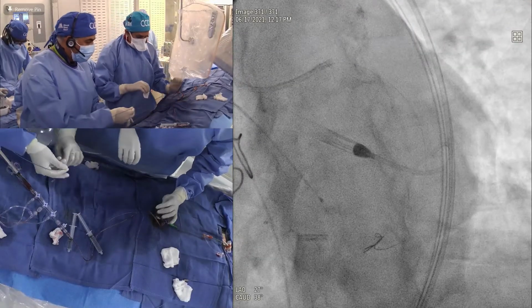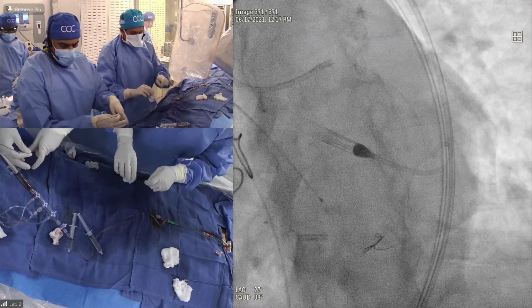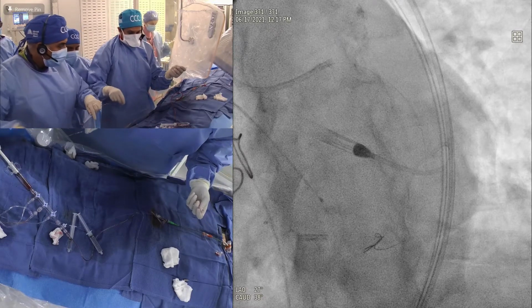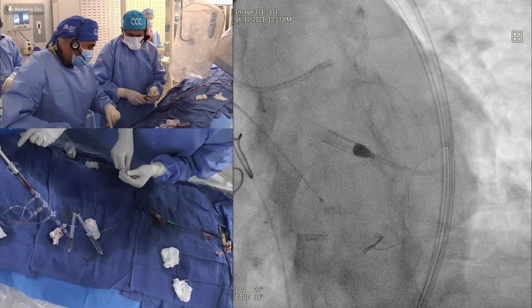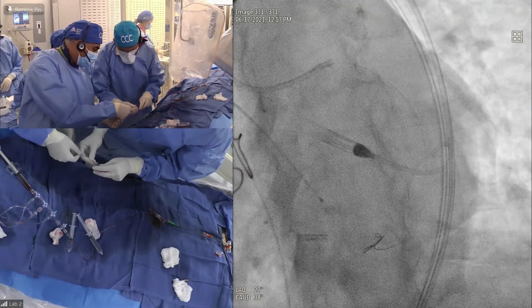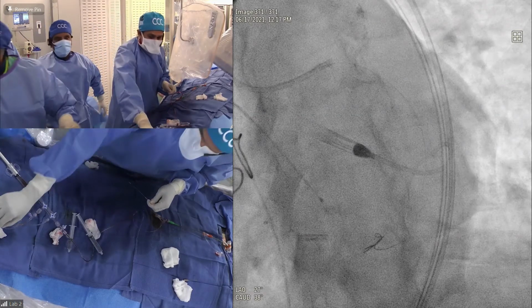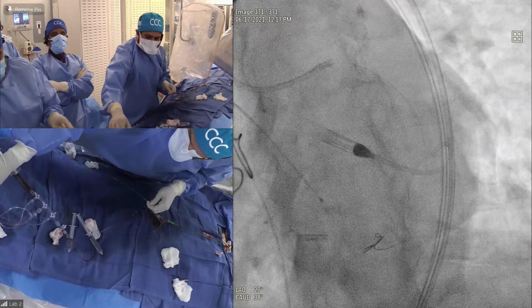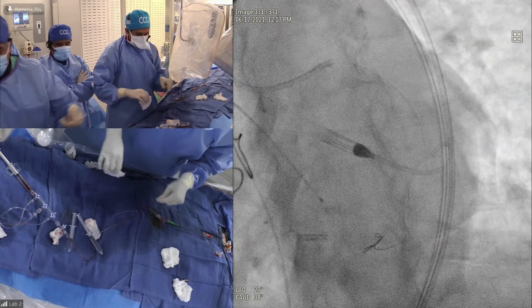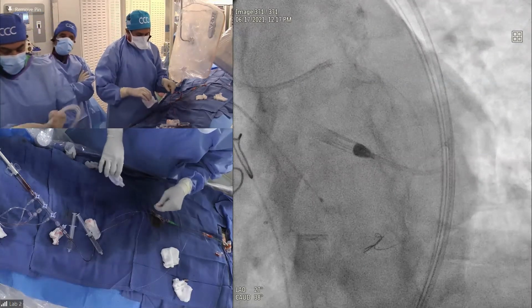Of course, not in those significant lesions, but I also think about the role of imaging. We find so much more when we do imaging. Everybody has their practice and everyone is very respectful of the great results you all have, but we wanted to make sure we mentioned the role of imaging and guiding intervention. And we will do FFR, IFR when it's indicated. So now you put the wire into the exact place where it was supposed to be. Yeah. So now the balloon will go.